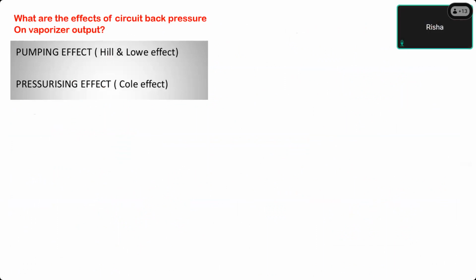When will it happen? Is it happening during spontaneous respiration or during controlled ventilation? Spontaneous ventilation, sir. The pressurizing effect is during controlled ventilation. Pumping?